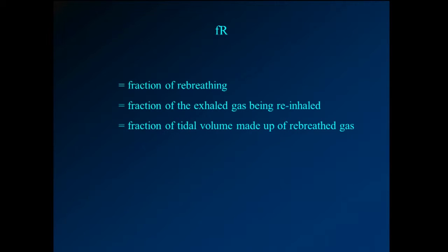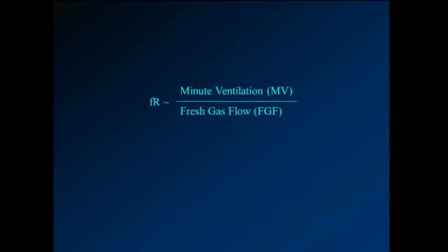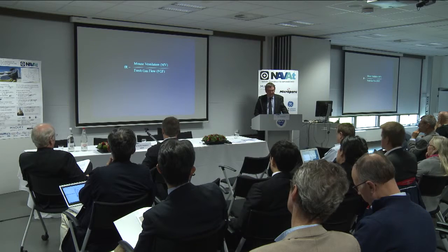What is the fraction of rebreathing? It's a fraction of the exhaled gas that's being re-inhaled. It's the fraction of the tidal volume made up of rebreathed gas. And intuitively, we know that if we lower our fresh gas flows, we'll be rebreathing more. If we increase ventilation, we will be mixing more. And, oh no, it's the other way around. So if the fresh gas flow decreases, we will be rebreathing more. Likewise, if the ventilation increases, we will be mixing more, and there will be more rebreathing as well.